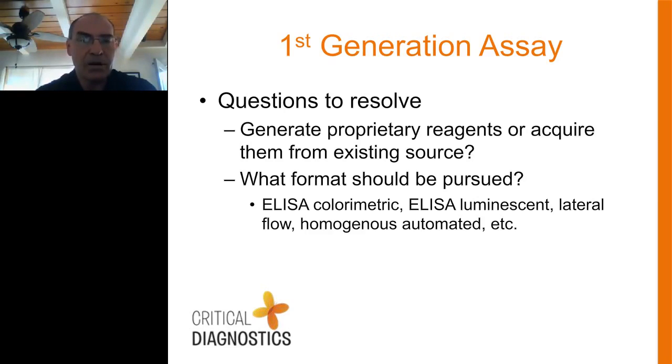Lateral flow is also a reasonable technique. It's widely used. It can be adapted quickly, but it has some performance characteristics that may not be completely suitable to initial characterization of a test. And some of those compromises are absolute sensitivity. It usually requires fairly high concentrations of an analyte to accurately measure. And it's a relatively noisy technology, so getting good precision is a challenge with lateral flow. It's not impossible, but it's not easy.